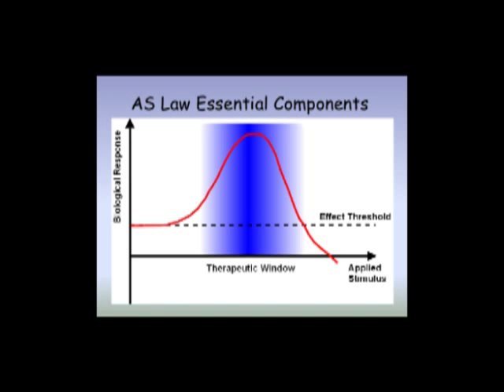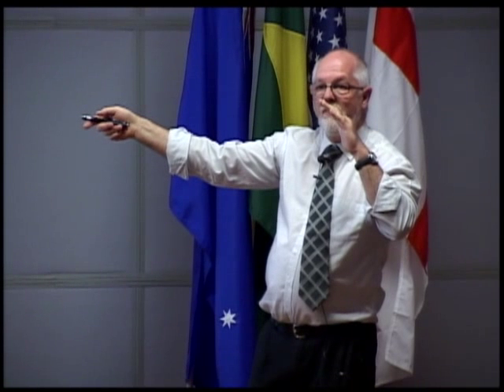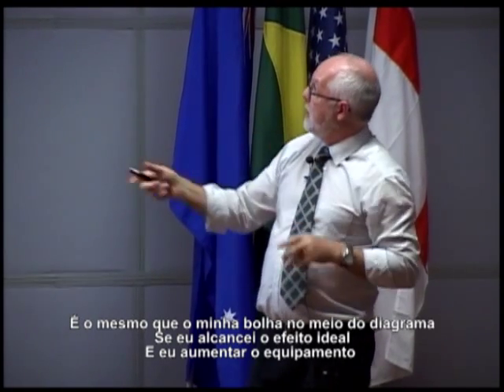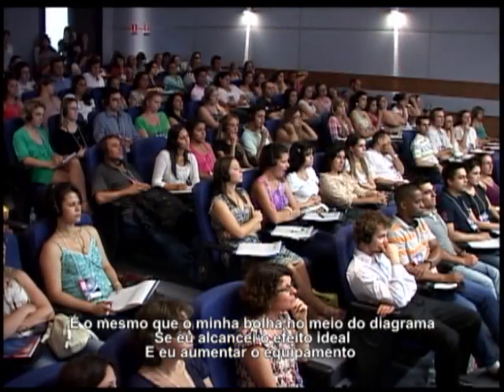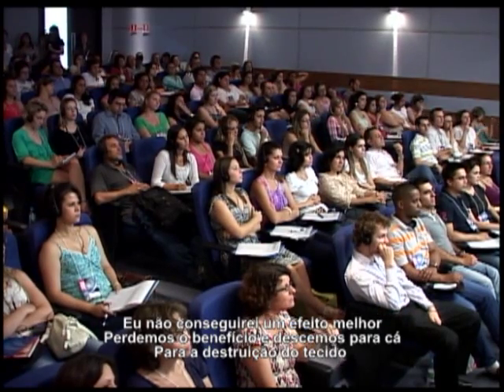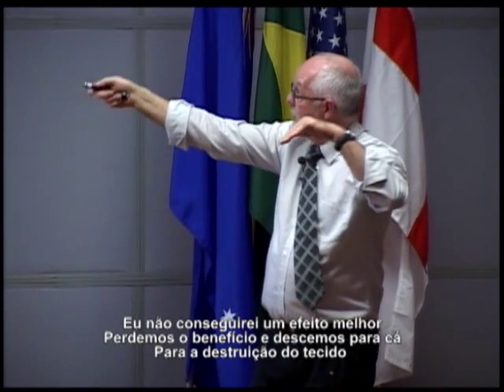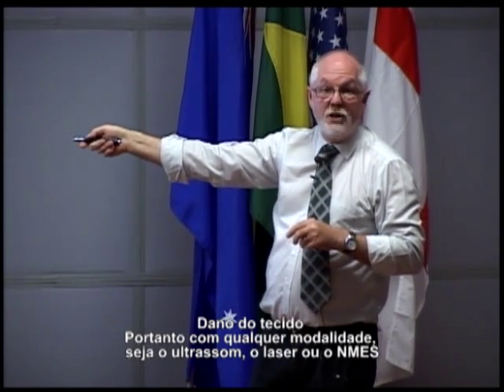But if we reach this point, this is our maximum effect, our optimum effect. That's the same as my blob in the middle of the diagram. If I have reached the optimum effect and I turn the machine up, I do not get a better effect. I lose the benefit, and we move down here to tissue destruction, tissue damage.